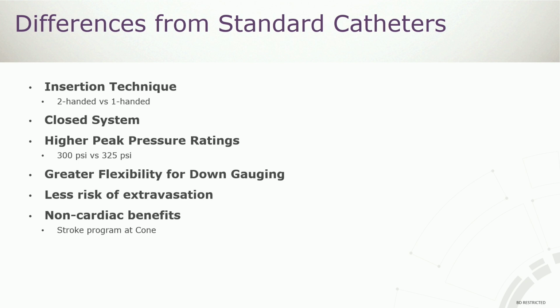Our stroke coordinator was really looking at the time between the non-contrasted head and the time to getting the contrasted studies. They wanted to know what our biggest barrier to getting those contrasted studies was, and they talked to the nurses and the techs. The biggest issue was IV insertion.